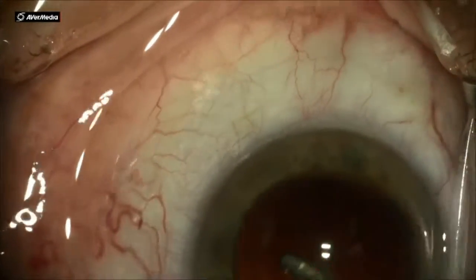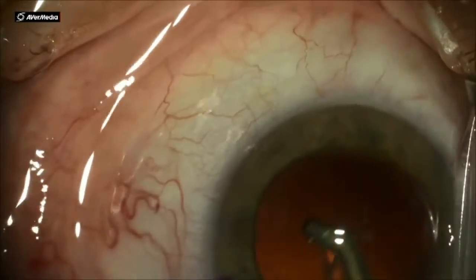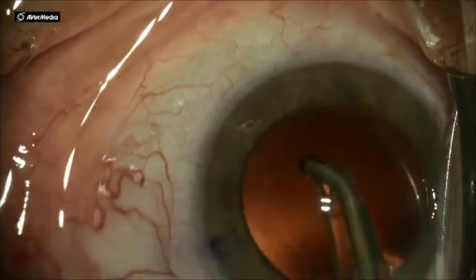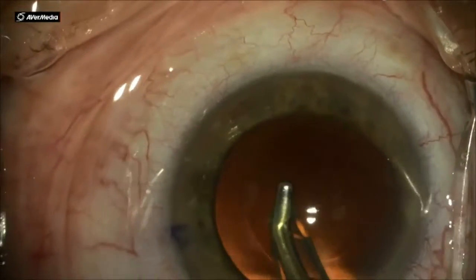Once that step is done and all the cortex is out, the next step is polishing. I don't change my tip — I just change the mode on my FACO machine and go to polish.